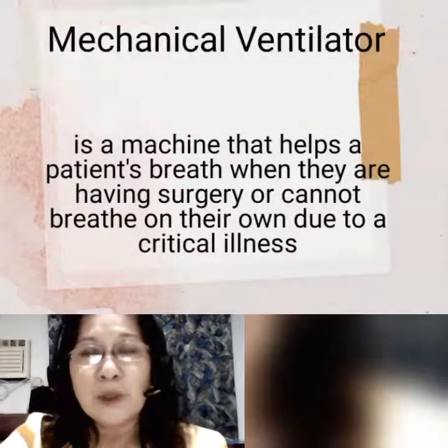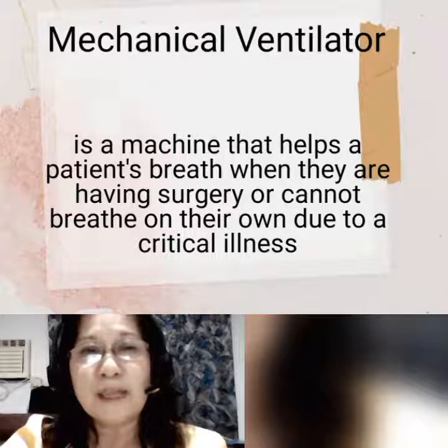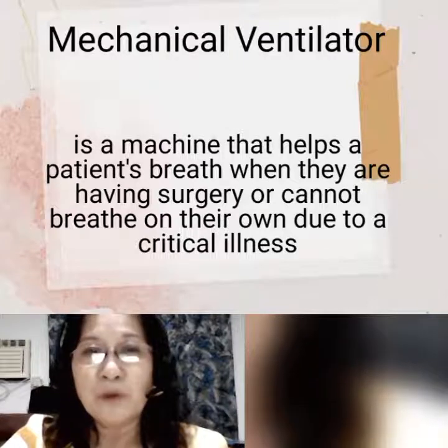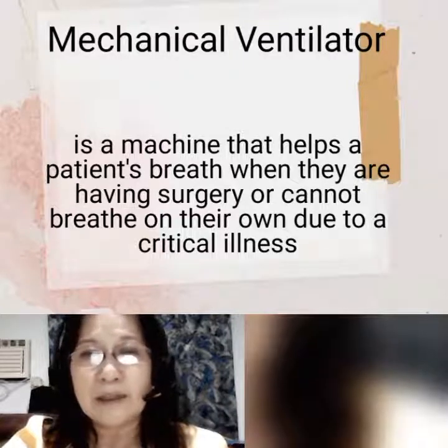So first, what is a mechanical ventilator? A mechanical ventilator is a machine that helps the patients breathe when they are having surgery or cannot breathe on their own due to a critical illness.